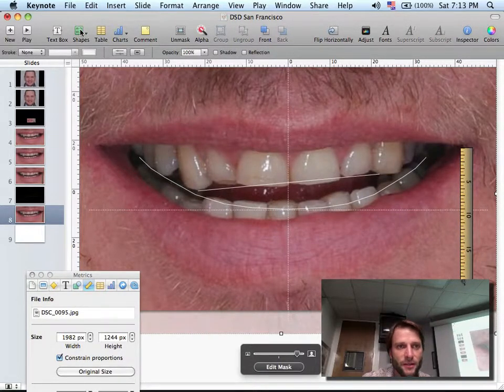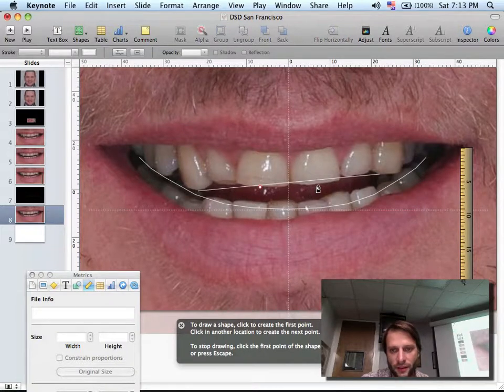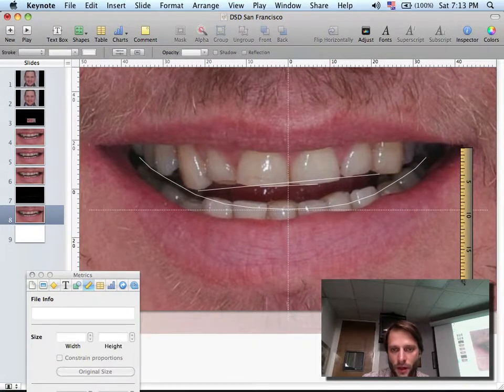I'm going to do the same thing on the centrals. Activate the pen. One click on the middle of the incisal edge of one central, double click on the middle of the incisal edge of the other, and we have the second line. Now the third line should be the tip of the papilla and the incisor embrasure, but it's already matching the hash marks. So it's already touching the other line, so you don't need to draw one line on top of the other. You just leave these two lines.